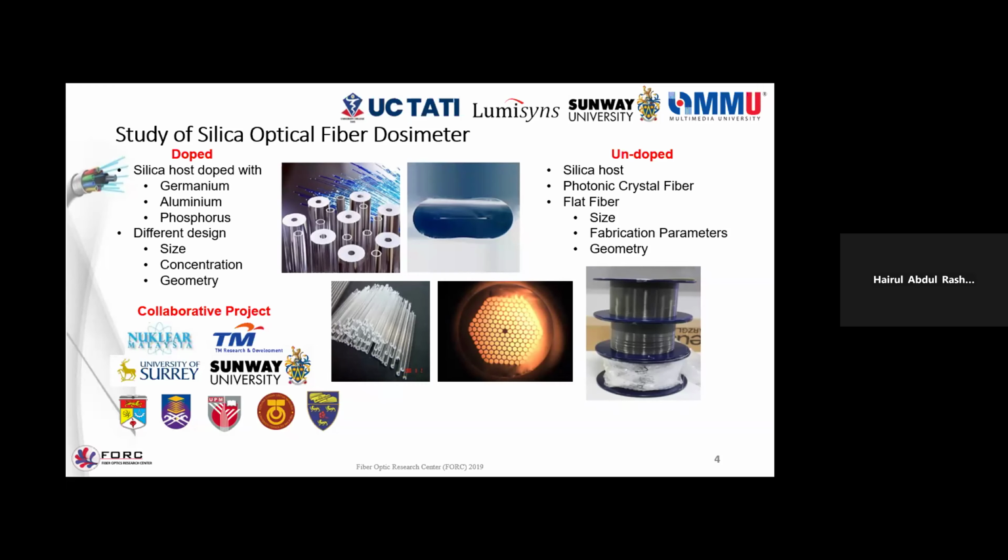We've also looked at different geometries of fiber, not just cylindrical, but also flat fiber, photonic crystal fibers, and so on. As far as dosimetry techniques, we started off with thermoluminescence, and we moved on to optically stimulated luminescence for a short bit, and focused most of our time now on radioluminescence as the dosimetry approach.